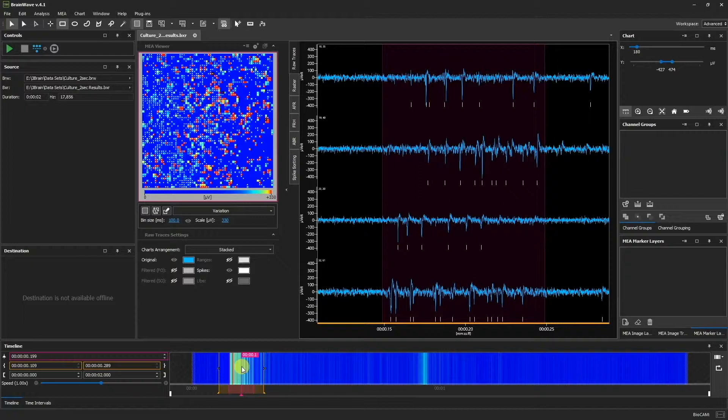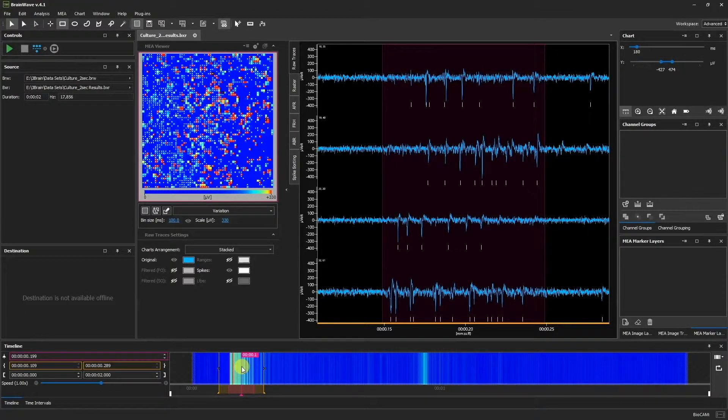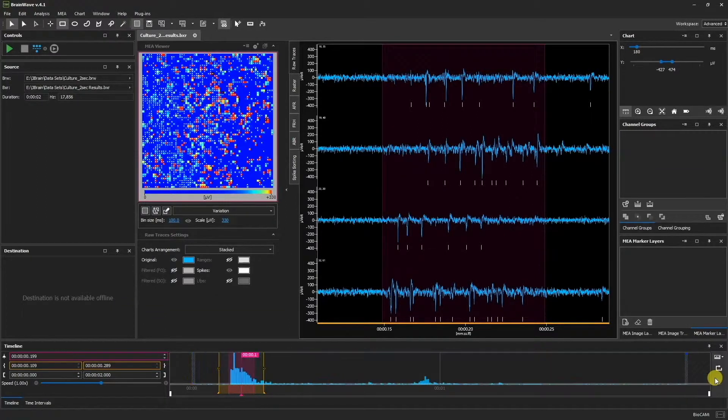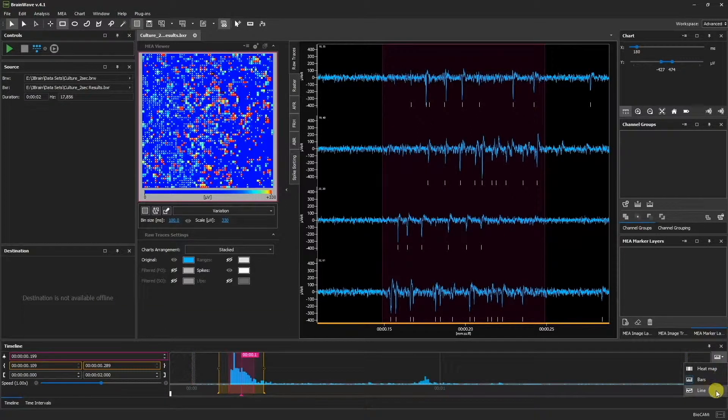We can also change the visualization mode on the timeline. Click Display mode to cycle through the heat map, the bars visualization, and the line graph.